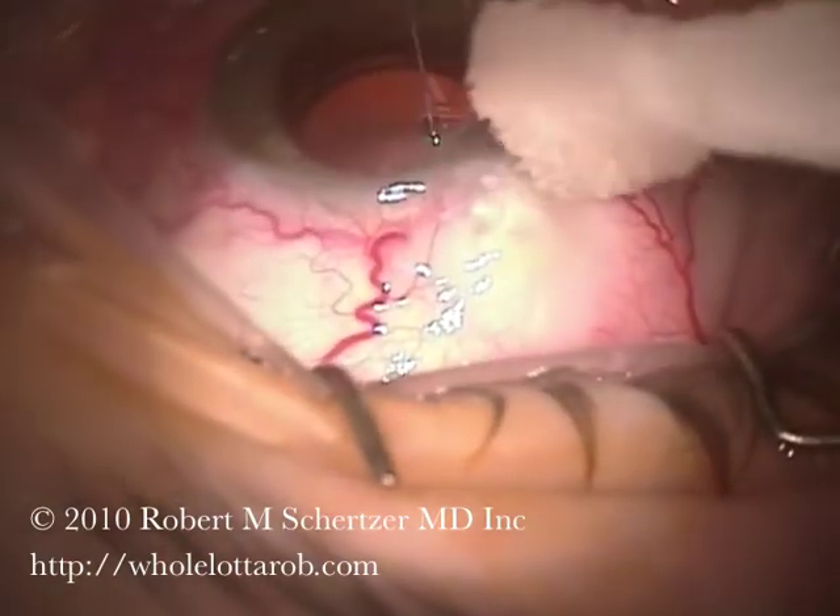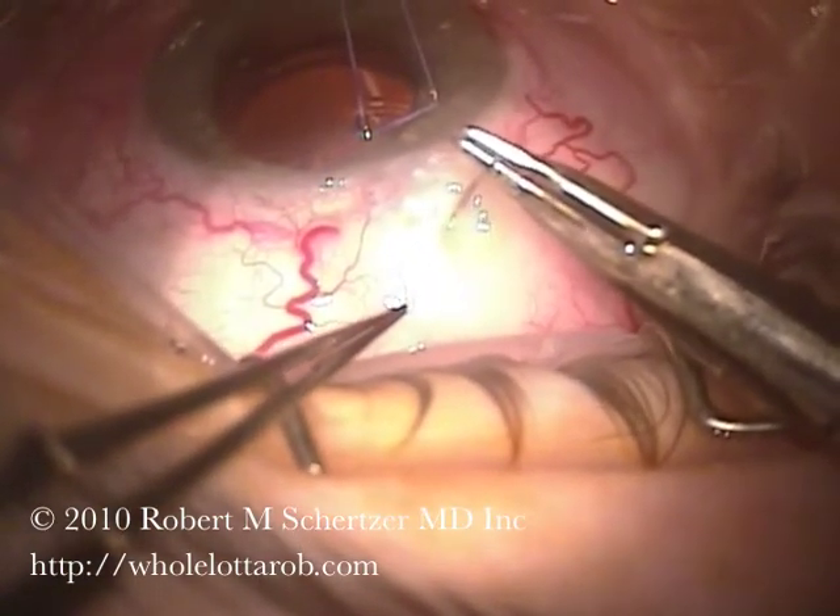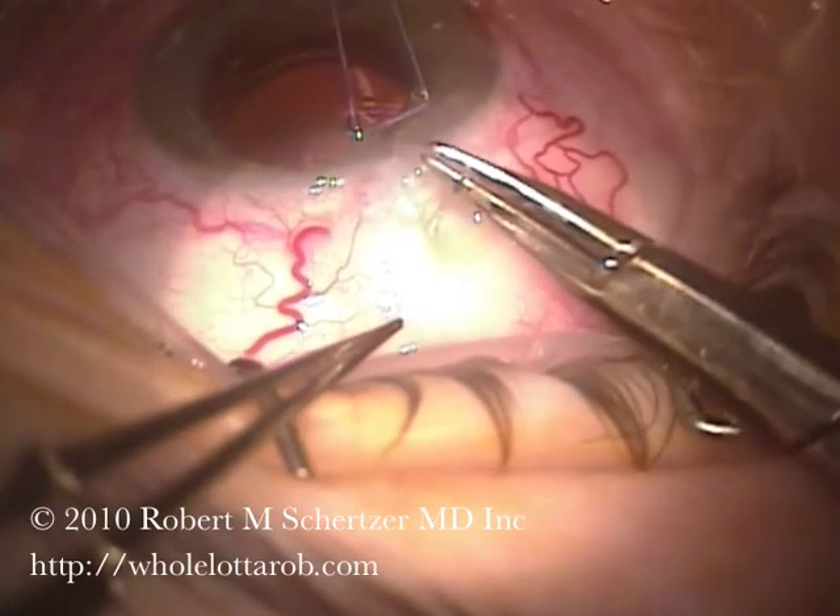In this case, you could see a few little blisters near the limbus where the fluid was really leaking out of, and the bleb is fairly high and quite diffuse.